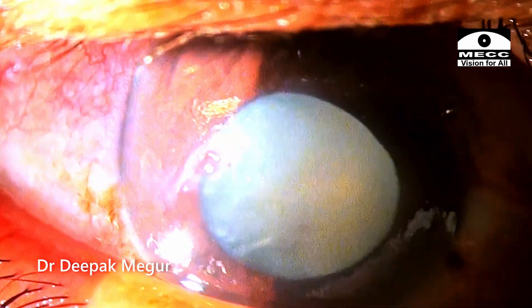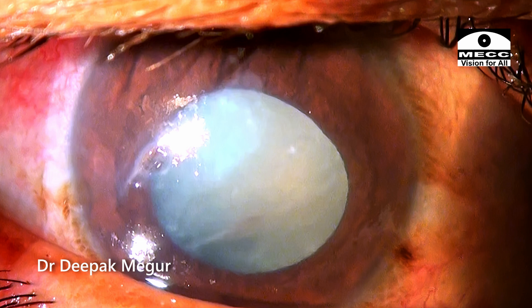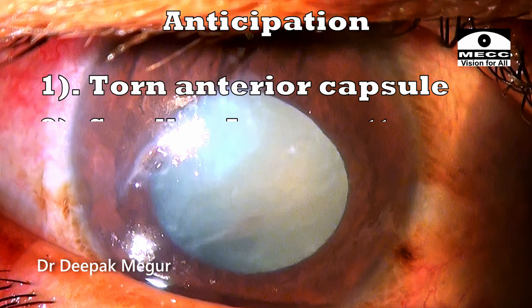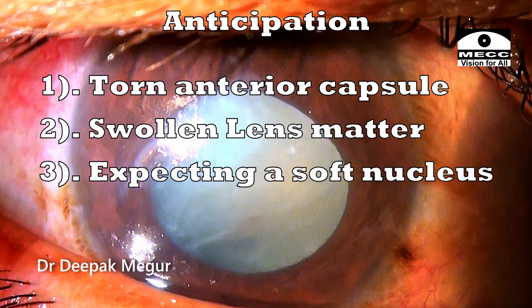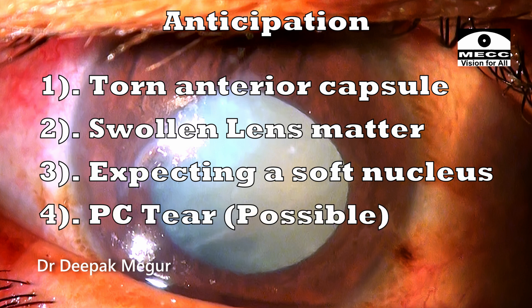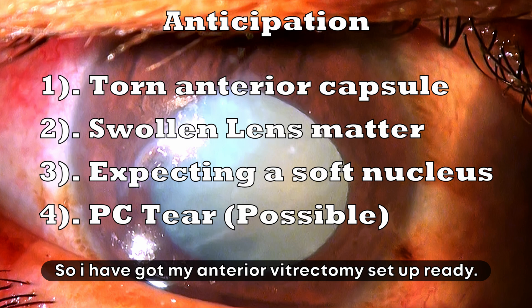Let me take you through all the things that were running in my head and how I planned for this case. I'm expecting a torn anterior capsule, a swollen lens matter, and a soft nucleus as the lady is around 45 years old. And of course, PC tear is a distinct possibility, so I have got my anterior vitrectomy setup ready.